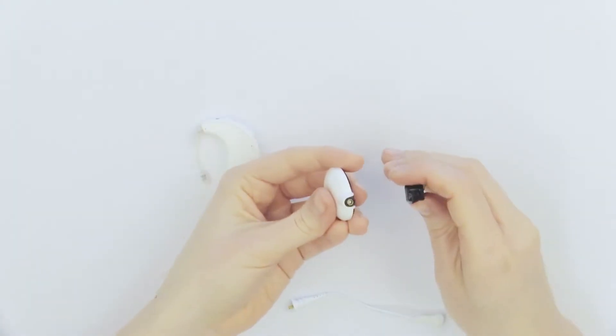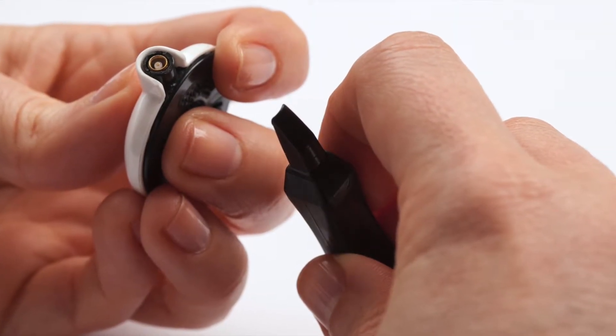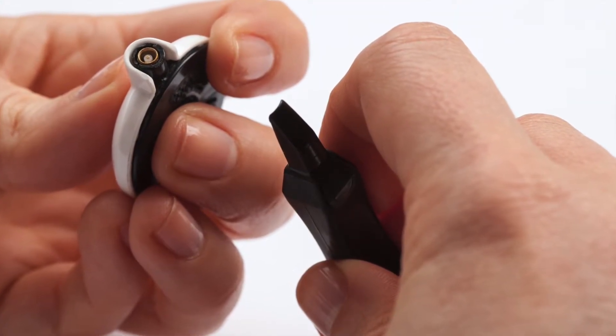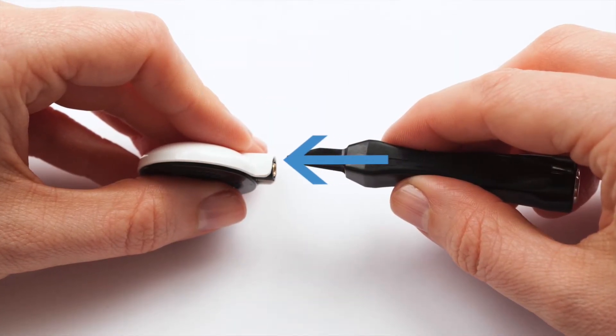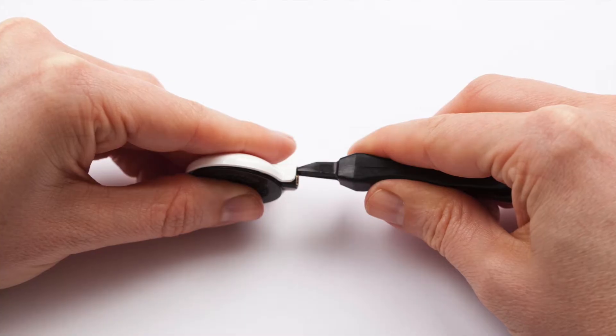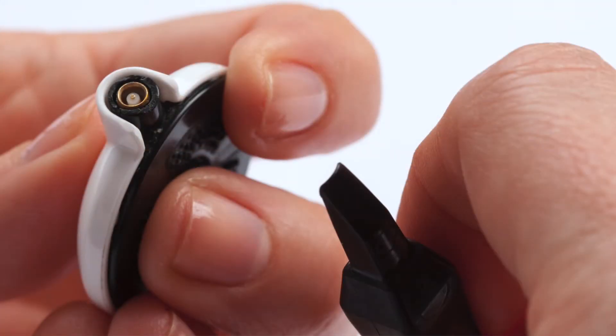To remove the colour cap from the universal headpiece, hold the UHP in one hand and the headpiece removal tool in the other hand. Slide the pointed end of the removal tool between the colour cap and the headpiece where the cable connector is located. Take care to match the curved portion of the tool with the curve of the cable connector.